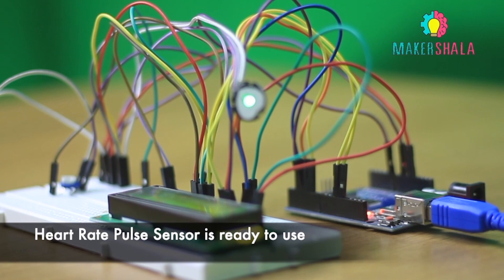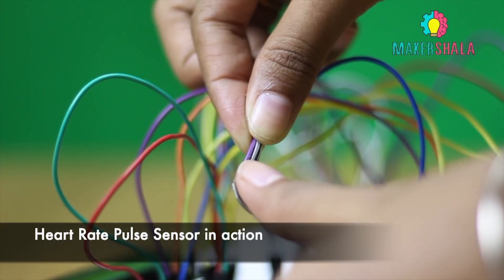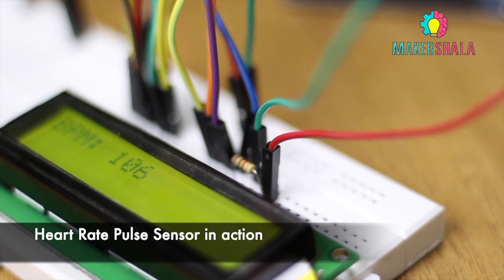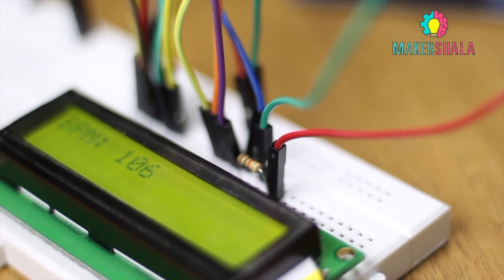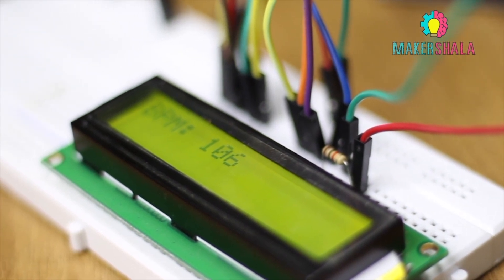We are done with the circuit. Now, as soon as you place your finger on this sensor, it will emit a light which will pass through the tissue. The reading will be converted into voltage by the controller. This reading will be visible on the LCD in a value converted to beats per minute.